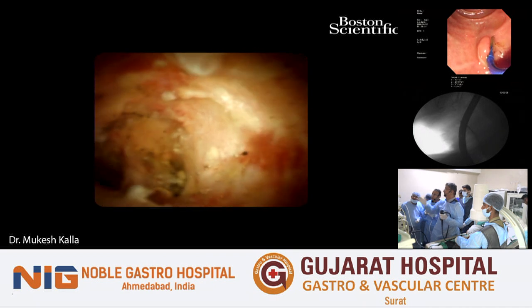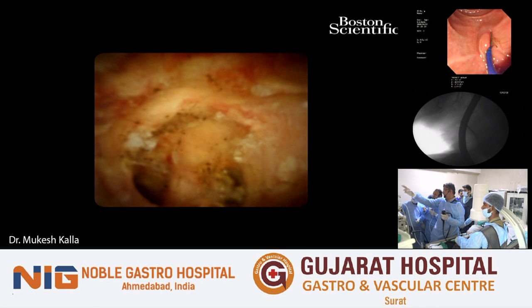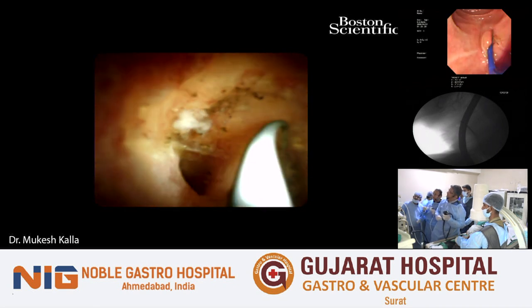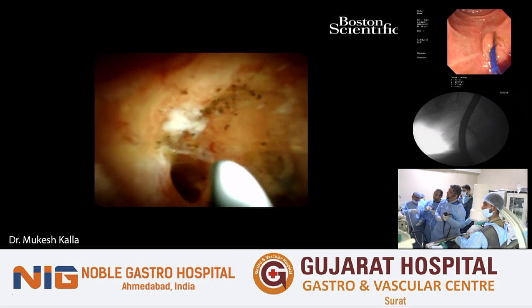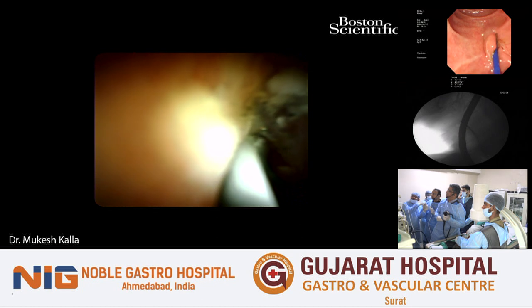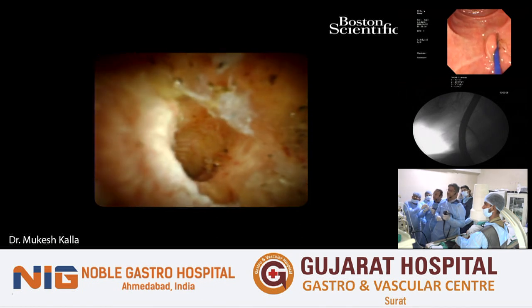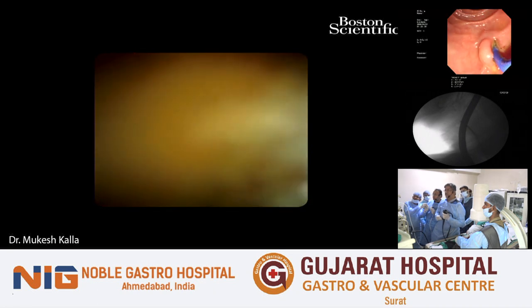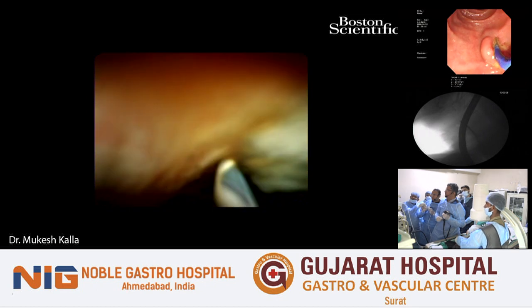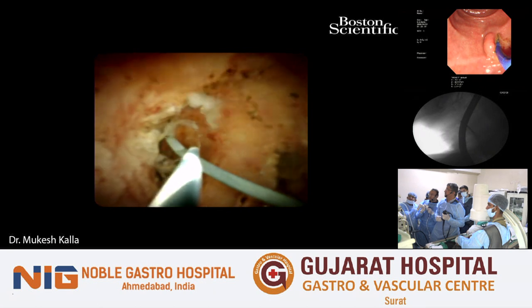Very nice demonstration. I would like to have your views about is there any change in your procedure or policy or selection based on the angle between the cystic duct and the CBD? Yes. See, when you have a lower insertion of the cystic duct, it is easy. But sometimes it can be an acute angulation, which would probably not even permit us for passing the cholangioscope also.